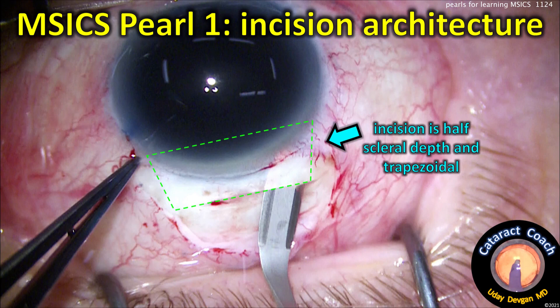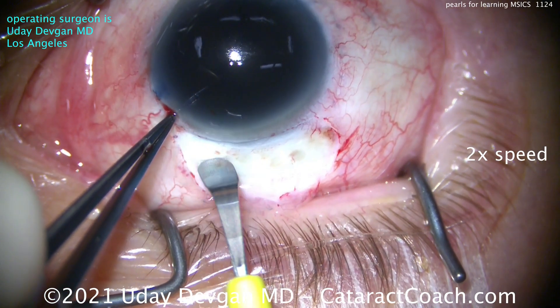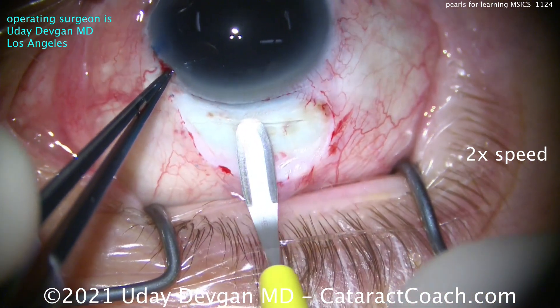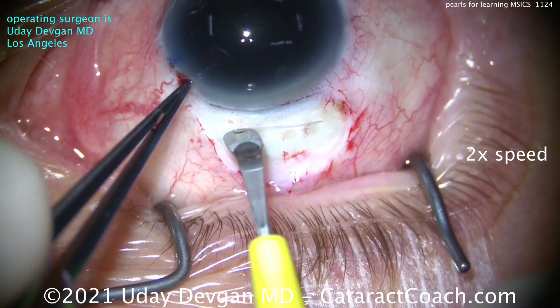The incision architecture is going to be about half scleral depth and trapezoidal in nature — wider internally than externally. Here's the groove, again about half scleral depth, using a crescent blade, nice and easy, taking your time.